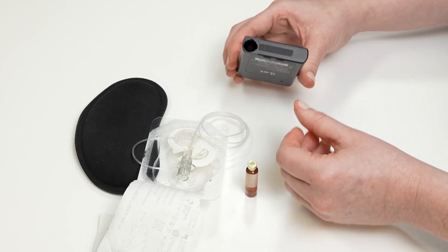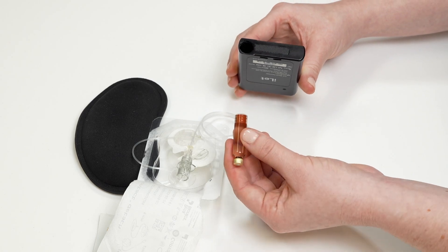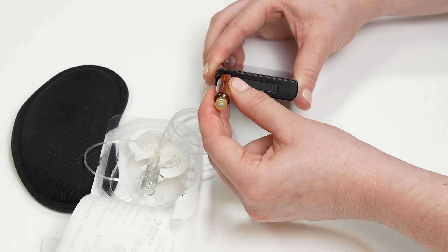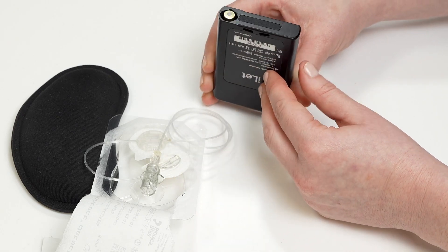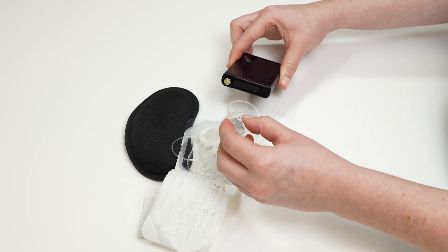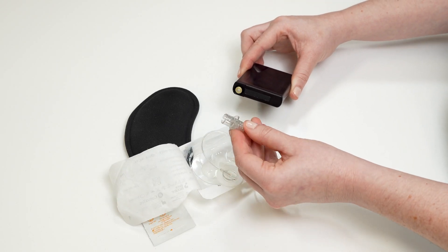After the rewind is complete, insert the new filled cartridge into the eyelet. Once the cartridge is inserted, insert the eyelet connect into the eyelet.